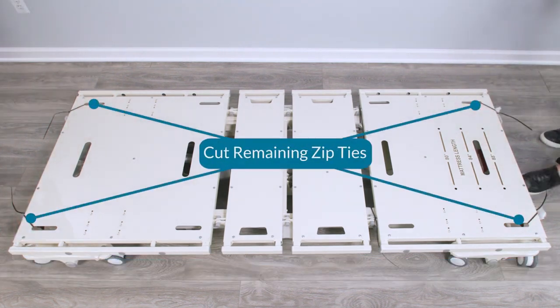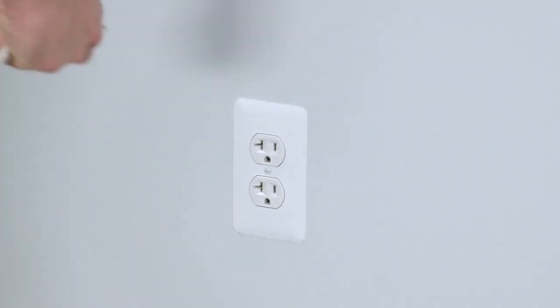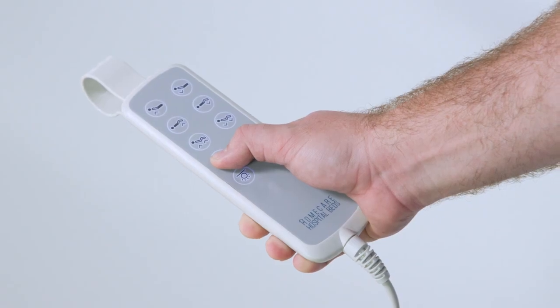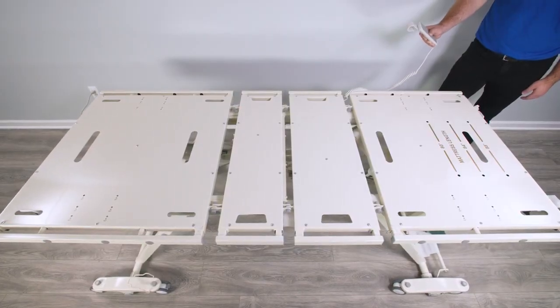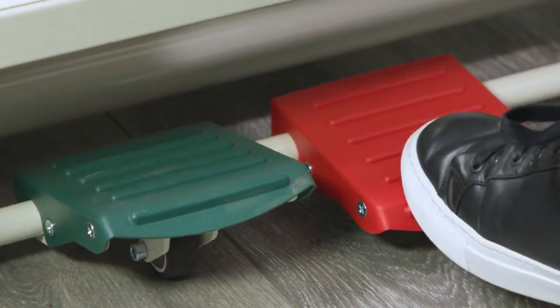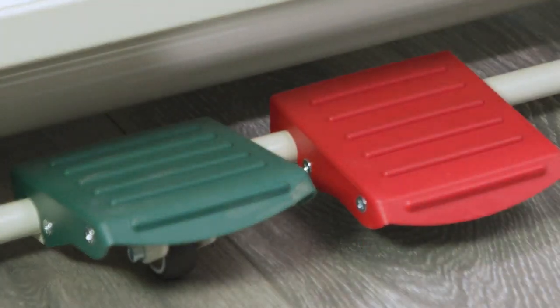Remove the remaining black zip ties from the bed deck. Locate the power cord and plug it directly into a wall outlet. Use the up button on the hand pendant to raise the bed to the highest position. After the bed is raised, step on the locking lever to ensure the bed does not shift during assembly.